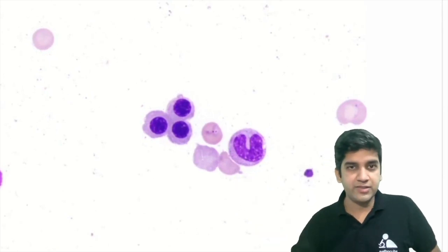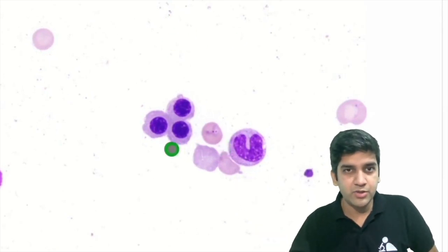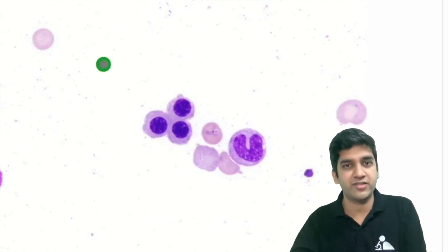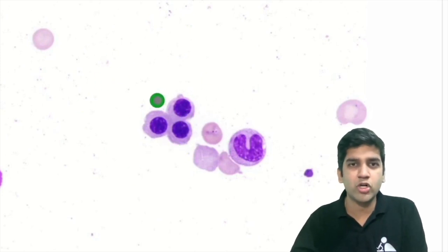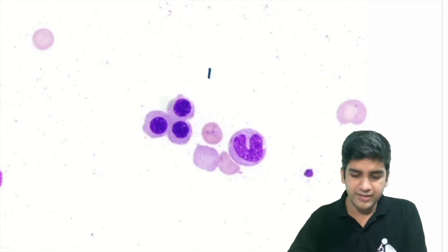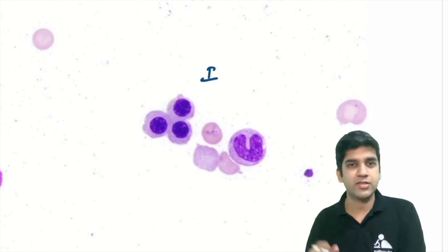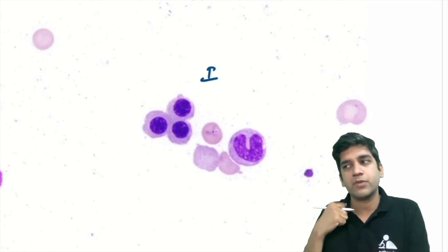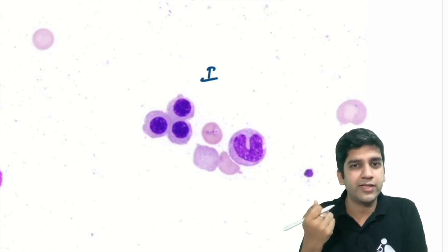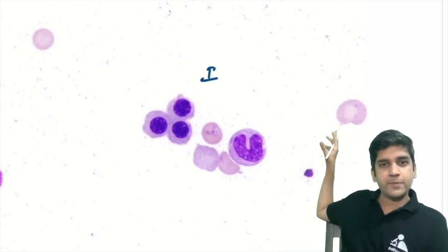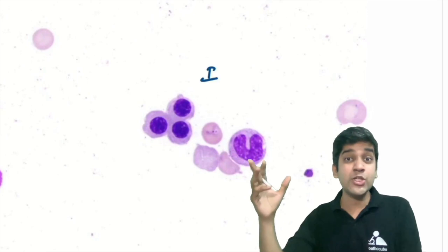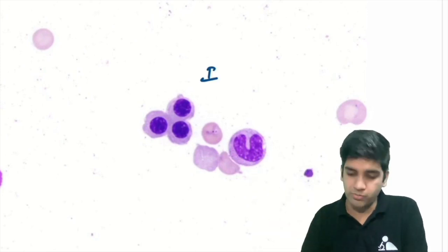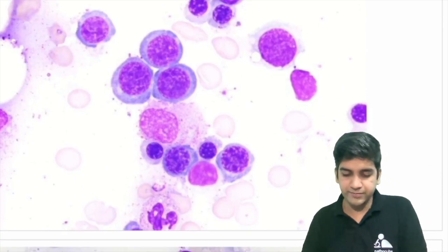Here you have an RBC, another RBC, and the cytoplasm of a nucleated cell — can I say this is a bit darker? It is an intermediate normoblast. The color is the key: it's polychromatic — neither clear like an RBC nor fully blue. The mixture of pink and blue tells me it's an intermediate normoblast.